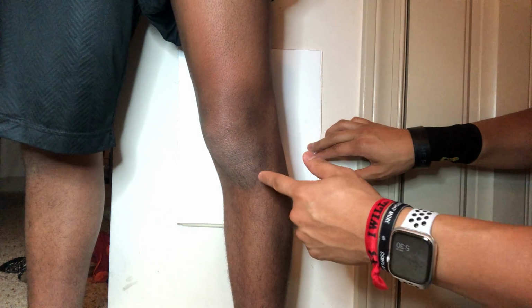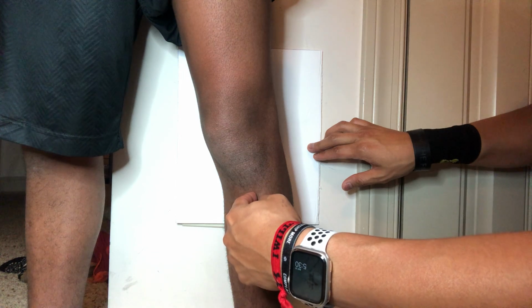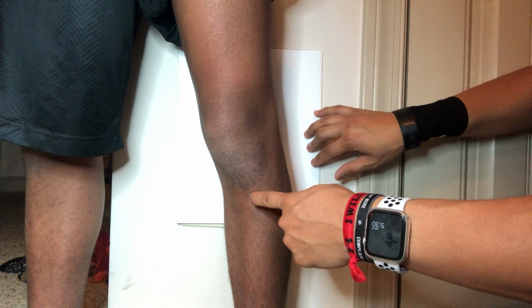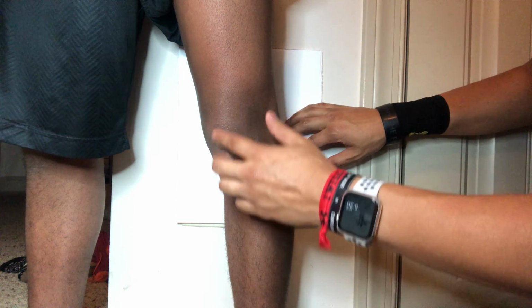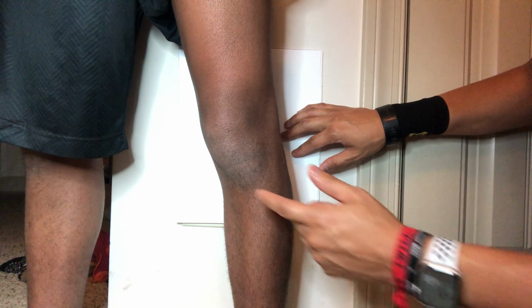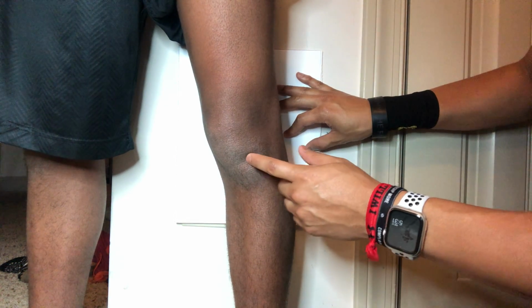For the AP knee, the central ray is going to be about a ½ inch below the apex of the patella through the center of the film space. We're going to collimate to include the bone and soft tissue structures of the knee, the distal femur and patella, as well as the proximal tibia and fibula, as well as the interspace between the tibial plateau and the femoral condyles.